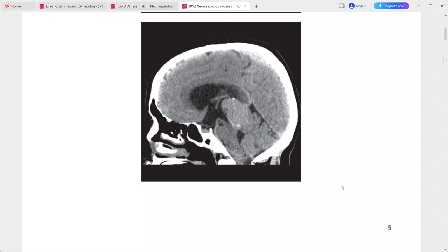This is pineoblastoma. Differentials include germ cell tumor, pineocytoma, meningioma, and astrocytoma of the tectum, thalamus, or corpus callosum. Management involves treatment of hydrocephalus first, followed by MRI of the brain and spine to detect CSF tumor dissemination prior to surgery. Treatment includes surgical resection with craniospinal radiation and chemotherapy.